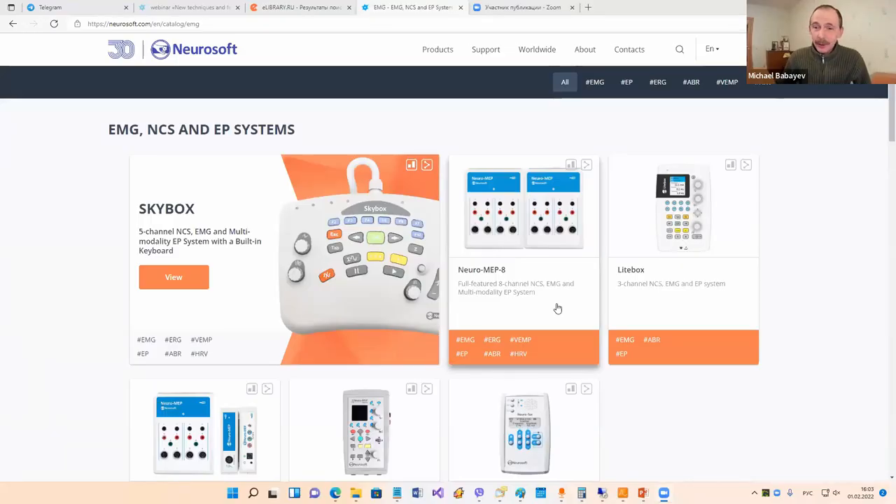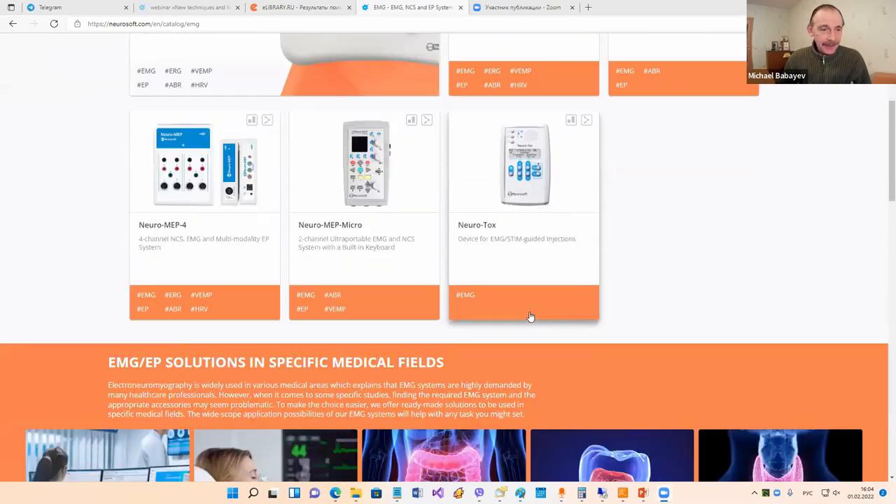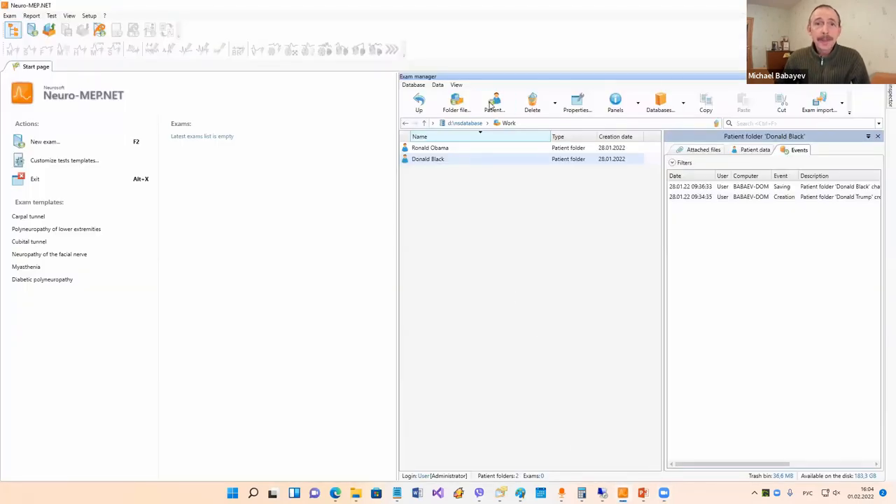I've already told you about our devices and here is the full list of our EMG devices. Here are also solutions - solutions for specific medical fields. Now let's go to our program and I'll tell you a few words about how to work with our EMG system.